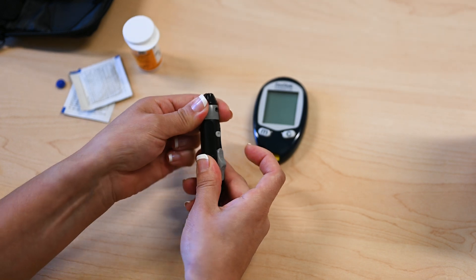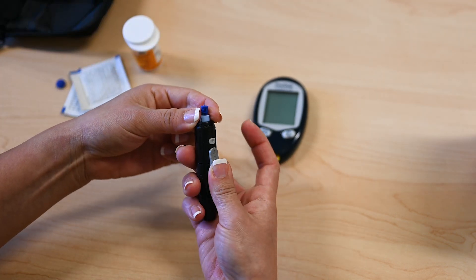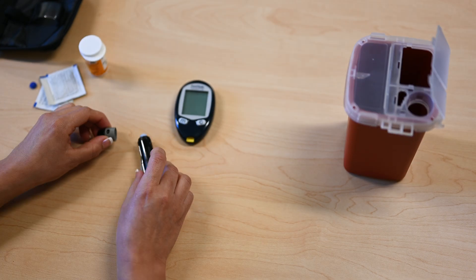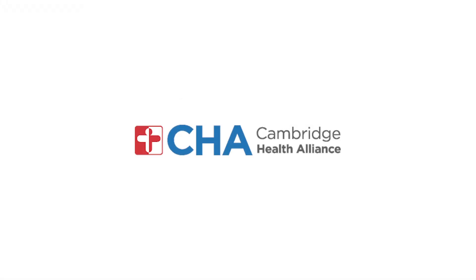Remove the used lancet. Place it in a hard plastic container to store your used needles, not the trash.